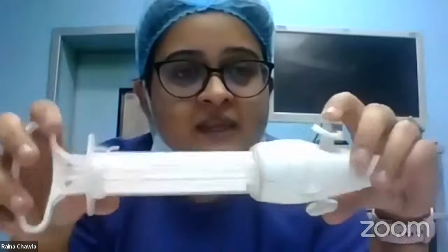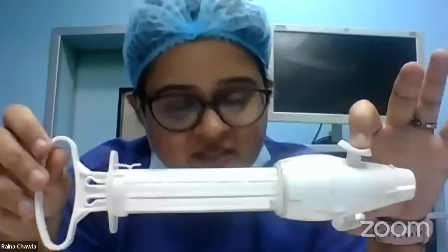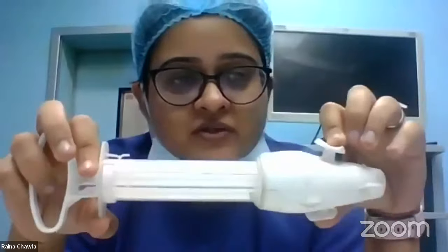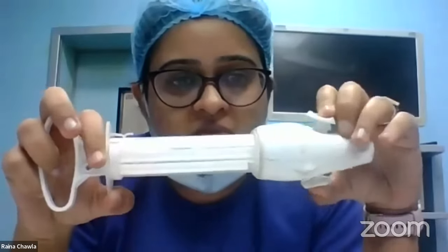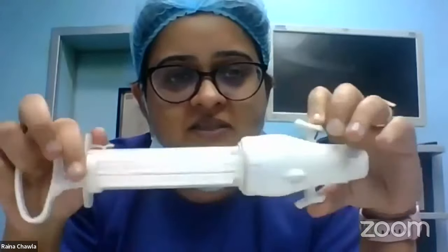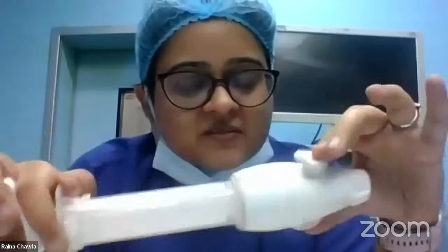What is this? This is a manual vacuum instrument. It was developed basically for low resource settings where electricity was a problem, where electrical suction apparatuses could not be used in rural places around the world because of electricity issues, and this has gained a lot of acceptance in recent times. This is the manual vacuum aspirator.